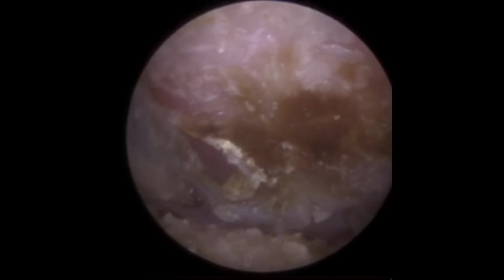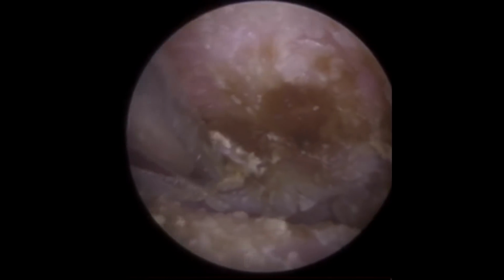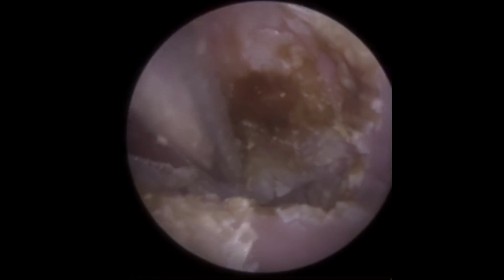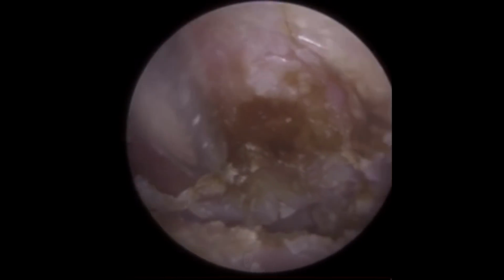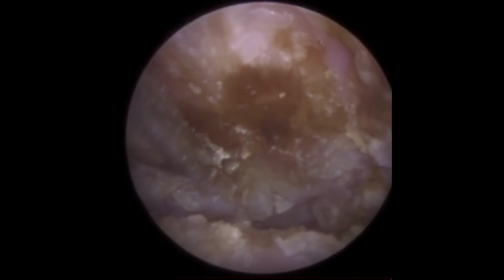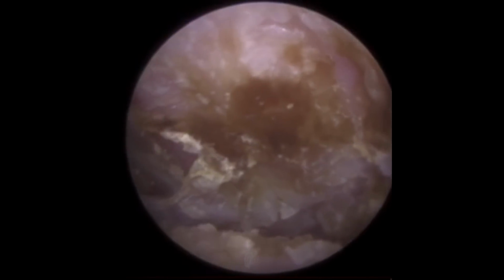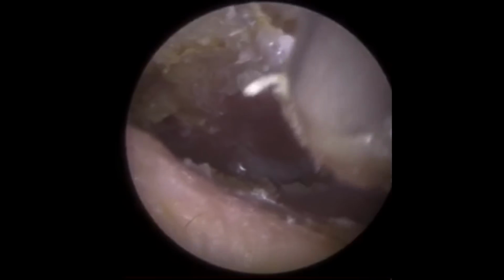So the top part of the eardrum, near the attic, the superior part, is called the pars flaccida, and that's a thinning of the eardrum. That's very thin and mobile and flexible, whereas the main body of the eardrum is called the pars tensa, and you have some concentric muscle fibres there which give some robustness to the eardrum. But of course, if we go in gung-ho with a sharp object like a fine forceps, you run the risk of puncturing and perforating the eardrum and causing pain to the patient.